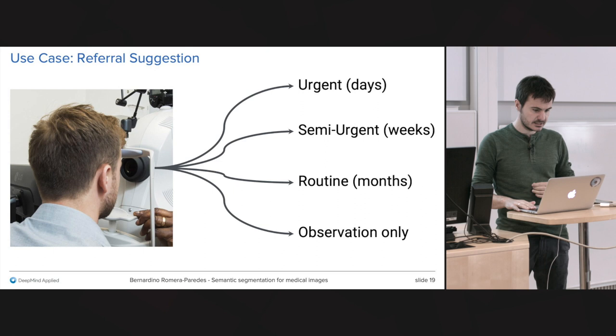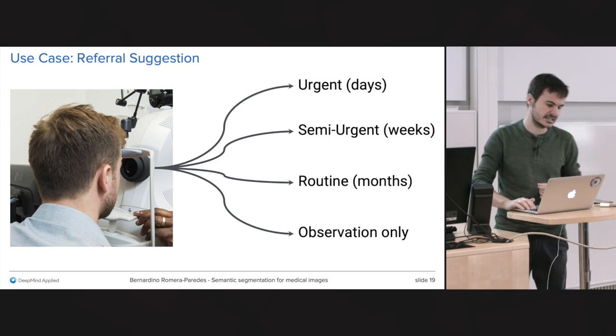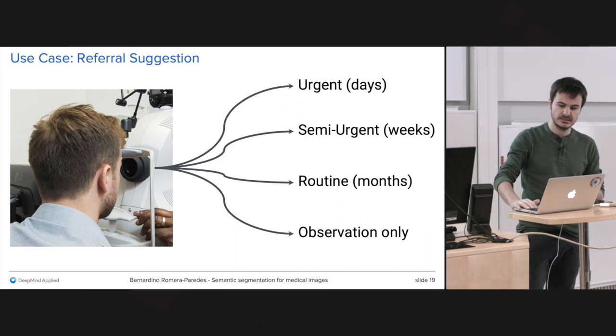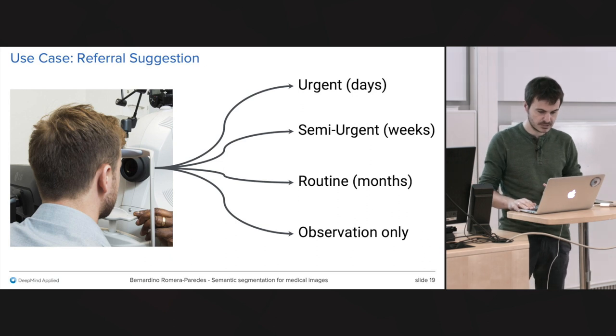So, as I said, the main use case of this project is to classify these scans in terms of whether they are urgent, so that the patient needs to be treated in terms of days; semi-urgent, in terms of weeks; routine, which is in months; and observation only, which is when the eye is completely healthy.